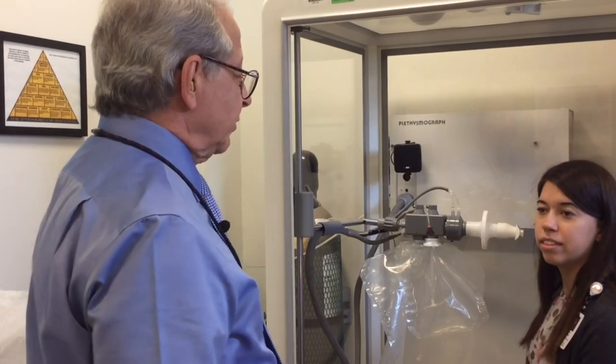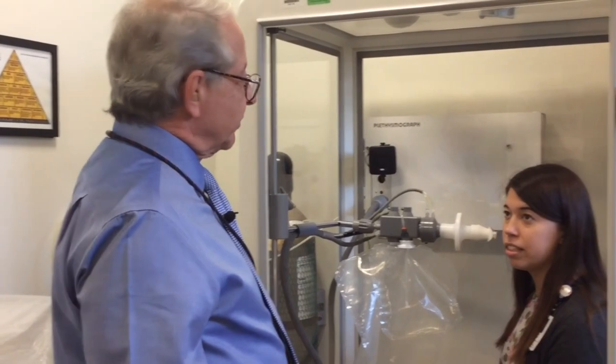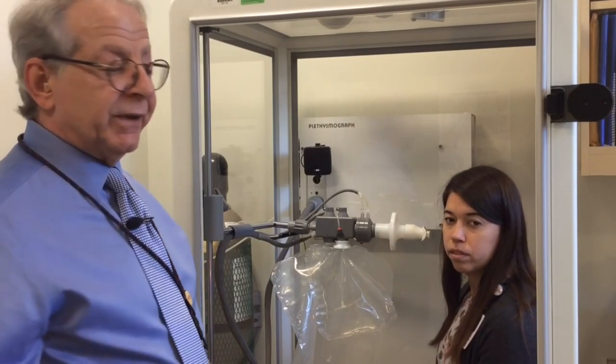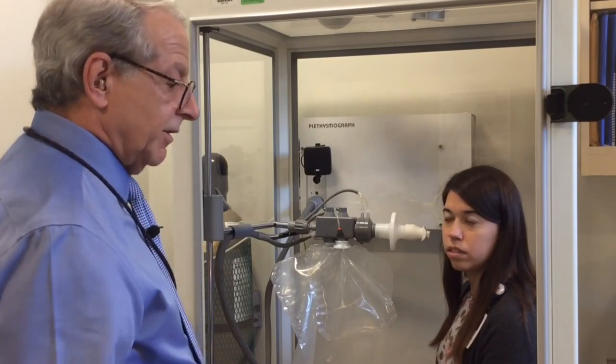The next test we're going to do is a lung volume plethysmography study. Lung volumes and airways resistance are performed in a body box. And we use this to measure static lung volumes, total lung capacity, inspiratory capacity, residual volume, and residual volume over TLC ratios. So I'll explain to Danielle exactly what I'm going to tell her to do.